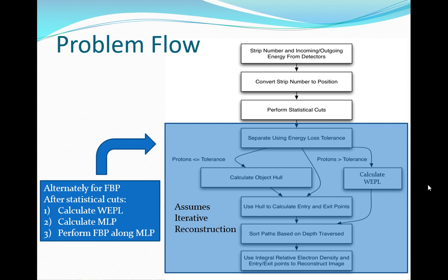So we have to do that here. They have to do that there because that's our, quote unquote, energy loss. That's your, in Ax = b, that's the b. Calculating the most likely path happens here. In this one, technically it is happening kind of in this zone here, right? We sort them based on it. We could do the MLP here or here. Usually it happens here for most of our stuff. We do it just in time.